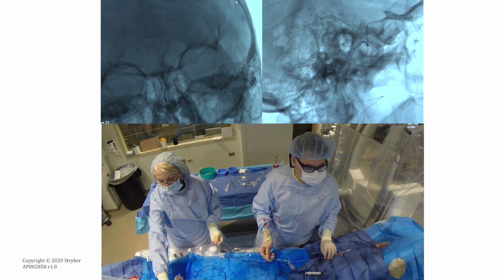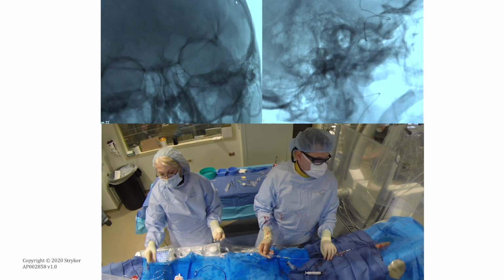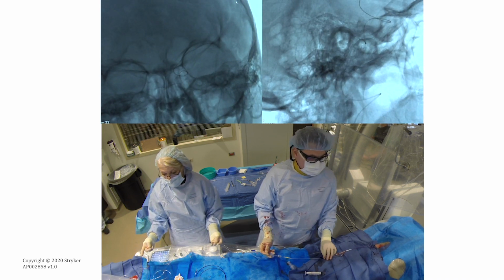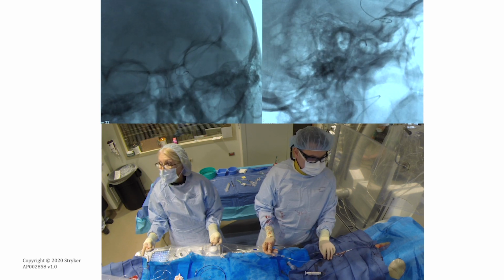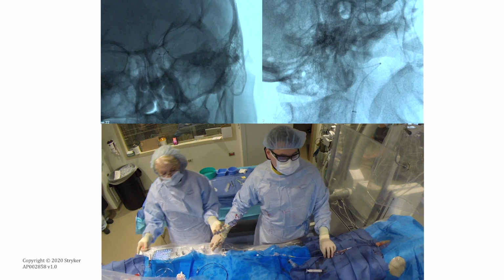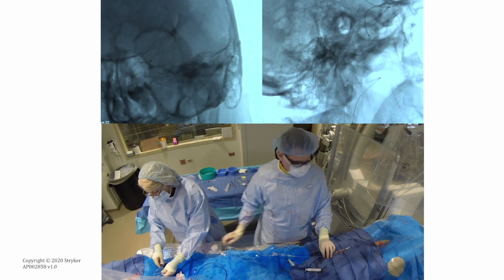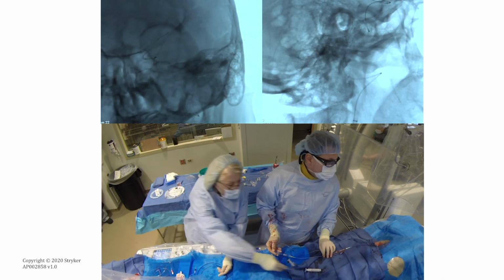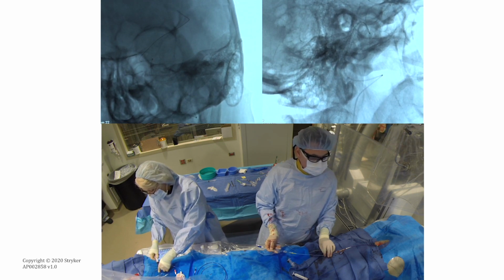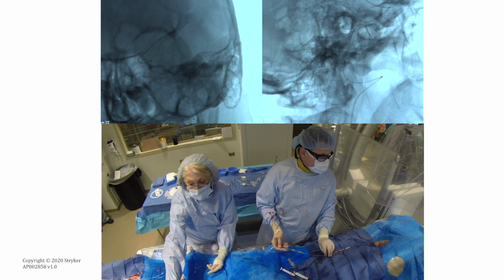I'm trying to find the best view here, as the patient is not under general anesthesia in this case, so the patient is awake and has some movements, as you can see. So you want to be very gentle with the wire on access to the distal anatomy, and once you have a position, always keep checking. You see here on the B plane the position of your balloon guide, so you can see that it has been advanced into the internal carotid artery over the Trevo microcatheter and the Synchro Support wire without any difficulties.